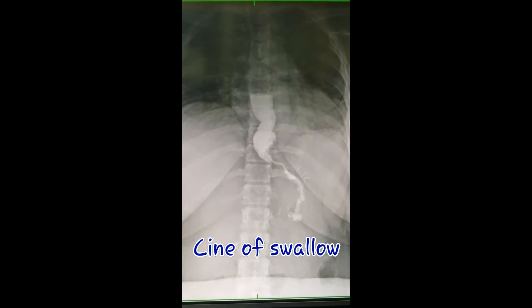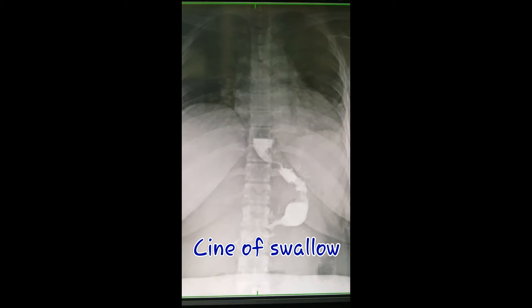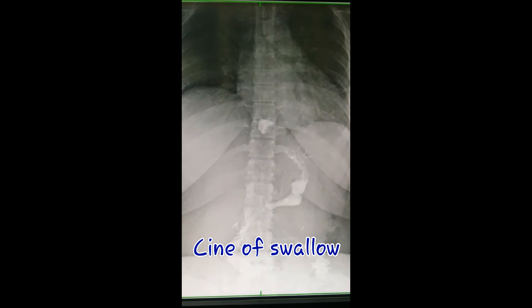In this case, we used gastrographin instead of barium sulfate due to the patient being 24 hours post-operative. We started the cine in the mid-esophagus according to the region of interest.